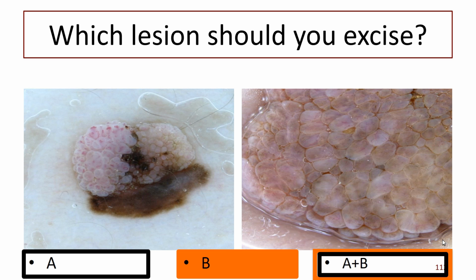Whereas here we have curls and squiggles and blotches, and here we almost have a circle. Very unusual pattern of blood vessel. When we see lots of different shapes of blood vessel, we might call that polymorphic. Quite often there's dots. We're not seeing dots in this one, but dots and linear pattern. So that's the short curved line.